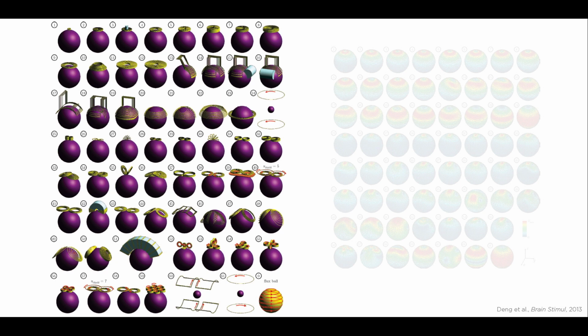In fact, there are many other TMS coil designs, and several years ago I went out to collect some of the coil designs that are produced by different manufacturers, and also theoretical proposals for TMS coils. And I have here cataloged more than 60 of these TMS coils, and I have categorized them loosely into 3 categories, which I'll tell you about in a second.